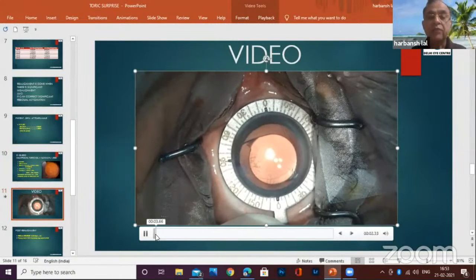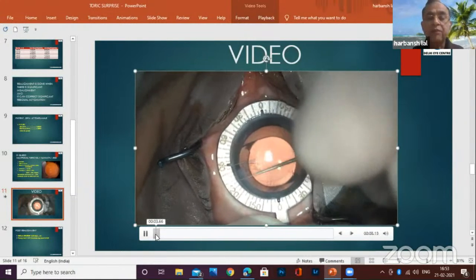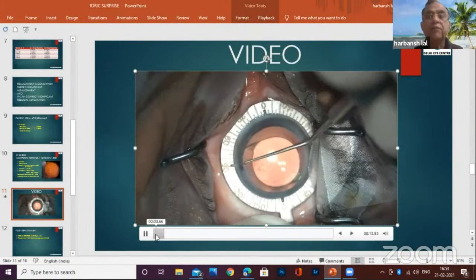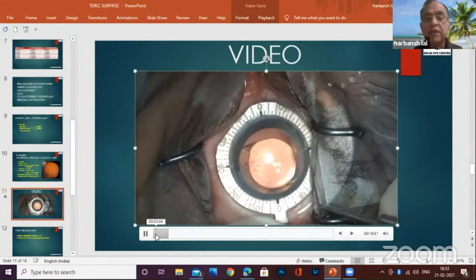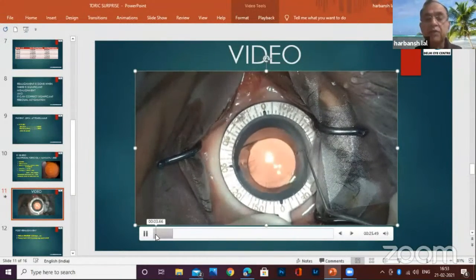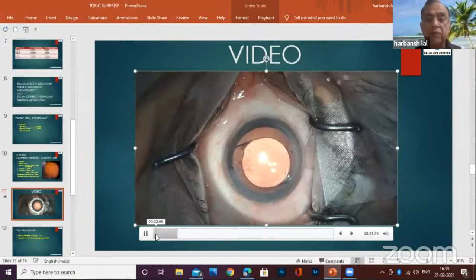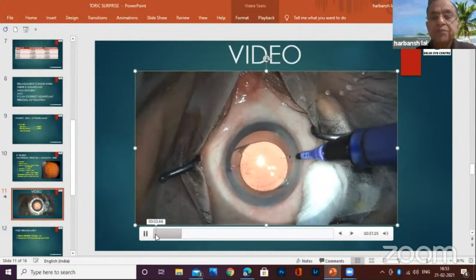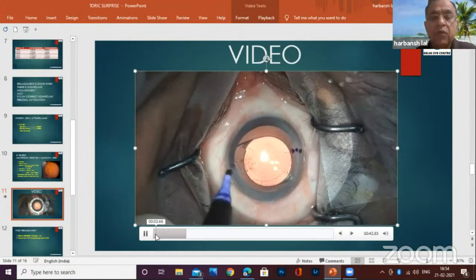So now if you see this, there is a mark on this, which I'm marking now at 90 degrees, and with 92, 93 at 3 millimeter and 81 at 4 millimeter, I'll be quite comfortable putting this lens at 90 degrees. My way of marking is I take a chopper, give an indentation with the chopper, and then put on an ink which stays there longer, or you can even put this chopper into the marking pen and mark over there. And then I put on an ink over there. So this axis is now being marked where I want my IOL to align.